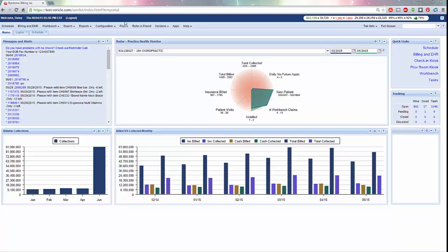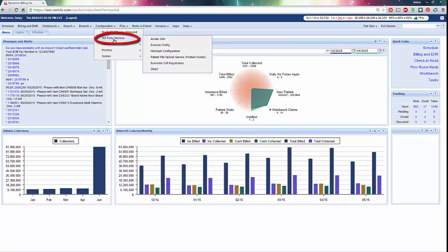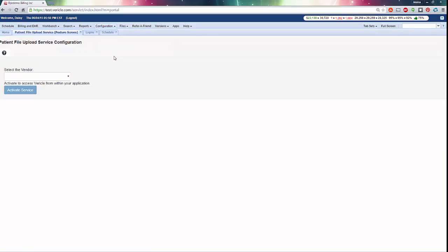Posture Screen and Posture Ray keys are configured in the system by going to Configuration, Third-Party Services, Patient File Upload Service. The keys are linked to a user's login. The Posture Screen or Posture Ray uploads will then have access to any patient accounts that user has access to.